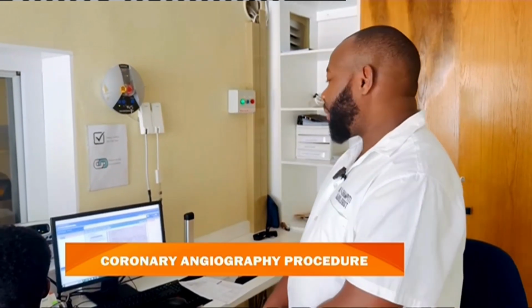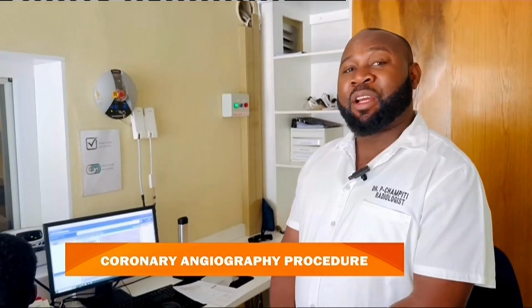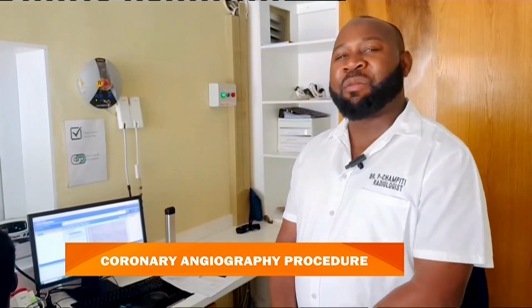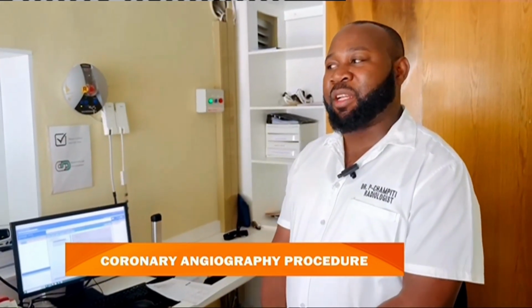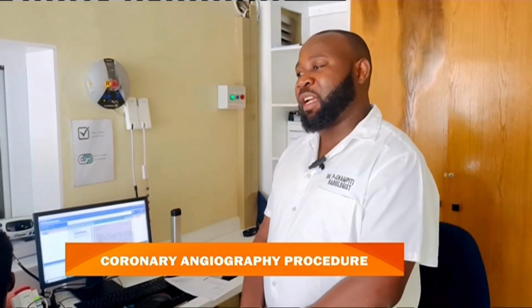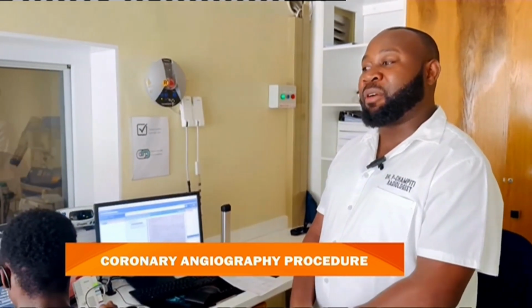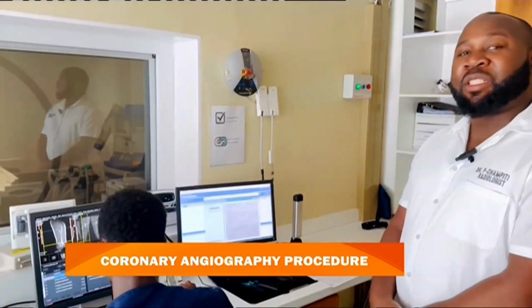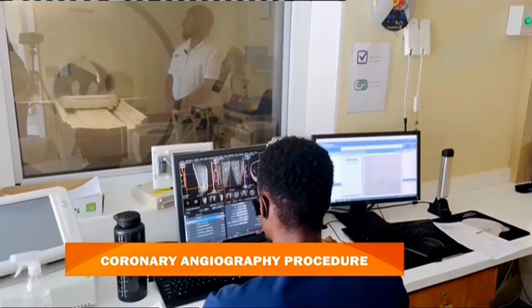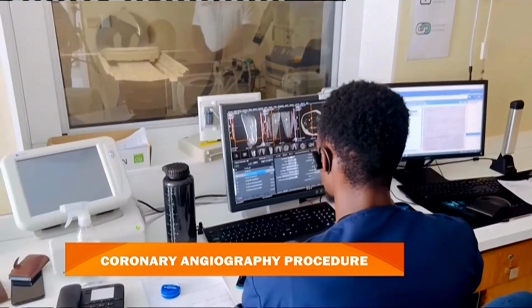It's a very smooth and a very agile machine because we're able to see a whole lot more than many other imaging procedures that we actually do know. Hence why we were mentioning something about the cardiac MRI, which we see in the near future replacing the coronary angiogram, as it is not invasive.